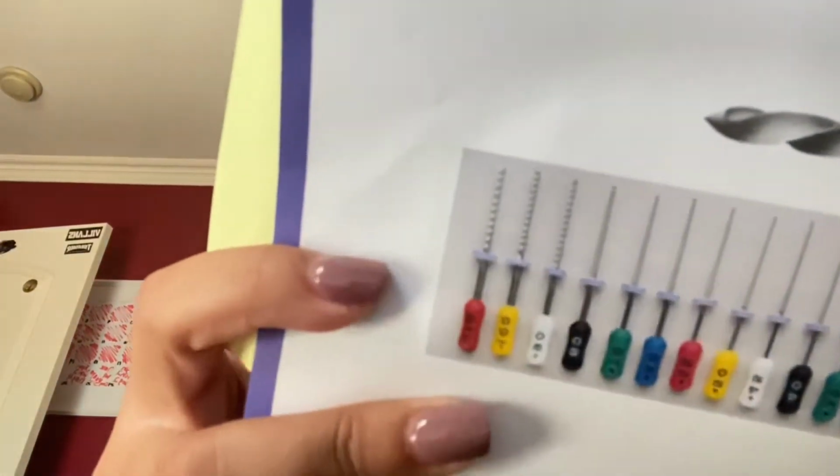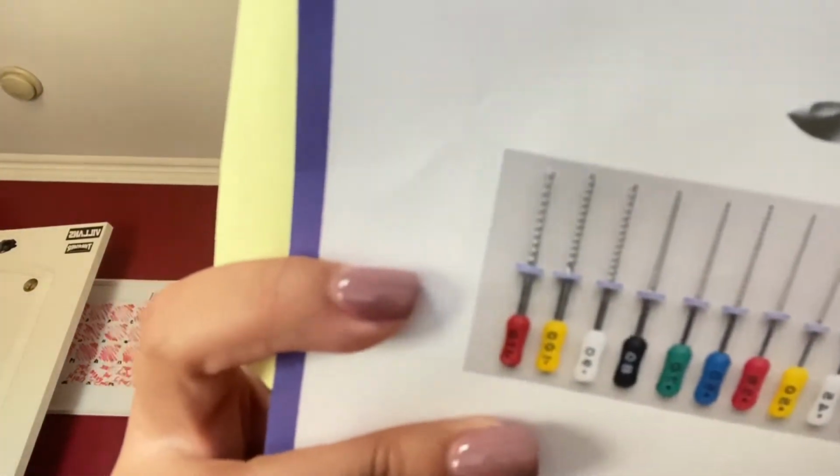And then for the second step, the doctor will use a K-type file, which is an endodontic file, which looks like this. This is used to locate, clean, and shape the canals. This is actually the most time-consuming step. The K-type file helps widen the canal, so the doctor can go ahead and access the pulp and stuff.